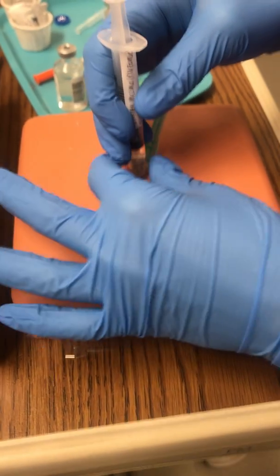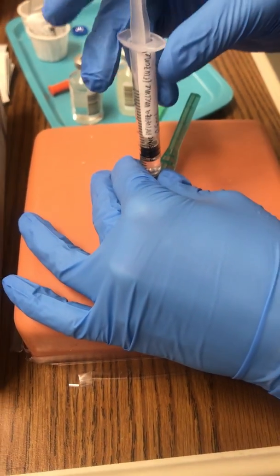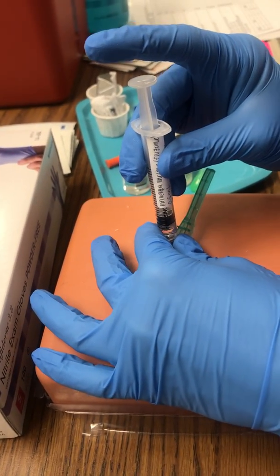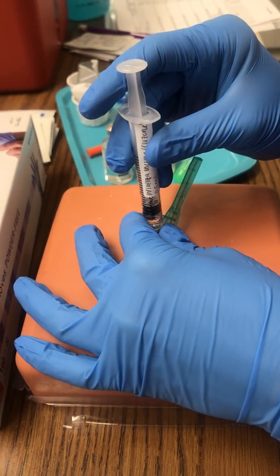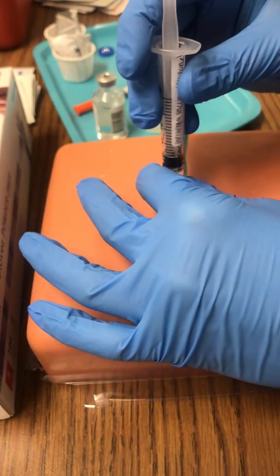Straight in. Stabilize my needle. I'm going to pull back and aspirate to make sure we're in the spot we want. Yep, looks good. So now I'm going to hold here, and then I'm going to push 1 mil per 10 seconds. And then after this, I'm going to hold for 10 seconds.